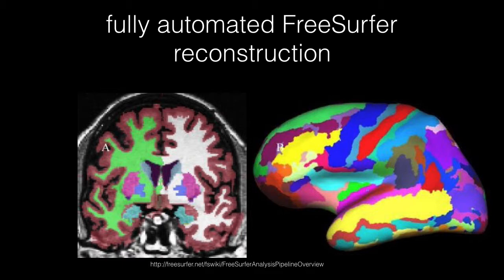The result is that each pre-labeled structure from the atlas has been warped in space so that its borders now match the borders of the corresponding structure in your participant's T1. In other words, if you were to layer one image on top of the other image and make the top layer partially transparent, you would see that the structures and boundaries in the aligned atlas pretty much line up with the structures and boundaries in your participant's T1. And that effectively allows the anatomical labels already present in the atlas voxels to be more or less directly transferred to the voxels of your T1.